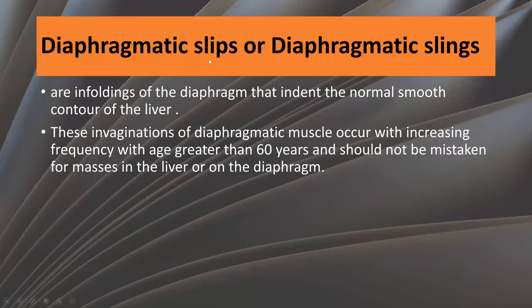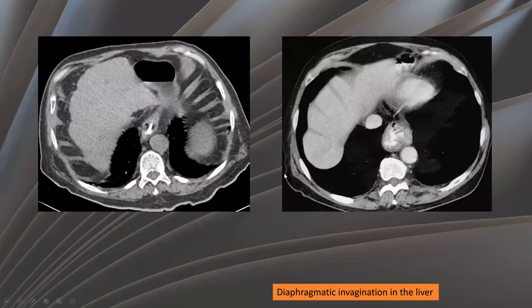Diaphragmatic slips or diaphragmatic slings represent enfolding of the diaphragm that indent the normal smooth contour of the liver. This invagination of the diaphragmatic muscles increases in frequency after the age of 60 years, and should not be mistaken for liver masses or diaphragmatic masses. Here are two patients with diaphragmatic invagination seen on axial cuts.